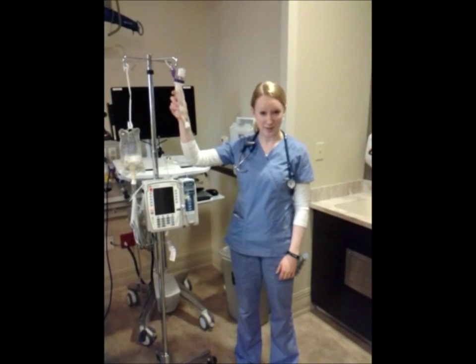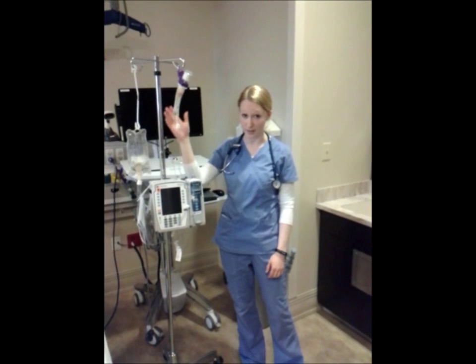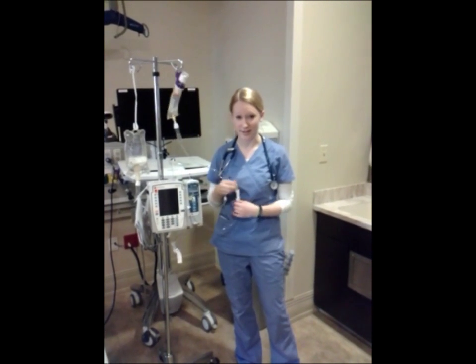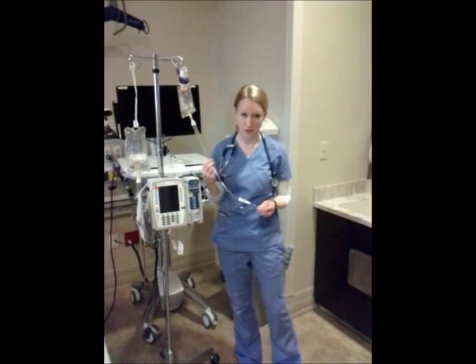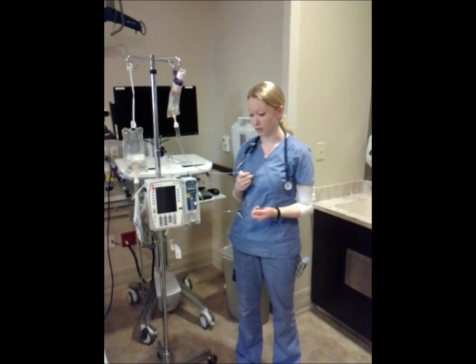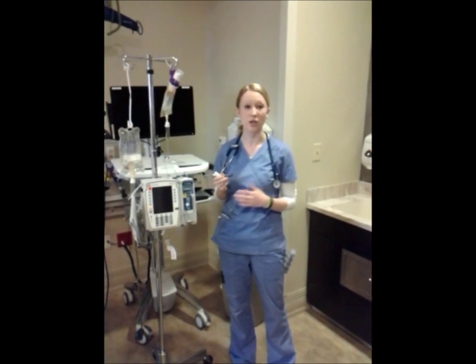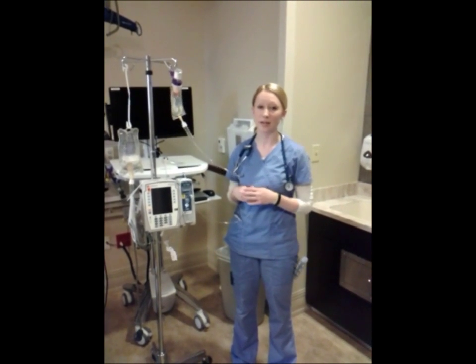I'm going to walk you through hanging a piggyback medication. You'll notice I've got my primary medication hanging lower than my secondary. You'll also notice that I have only one set of secondary tubing, and that is to prevent the need to reconnect and disconnect between different secondary infusions, which helps prevent the risk for bloodstream infections.